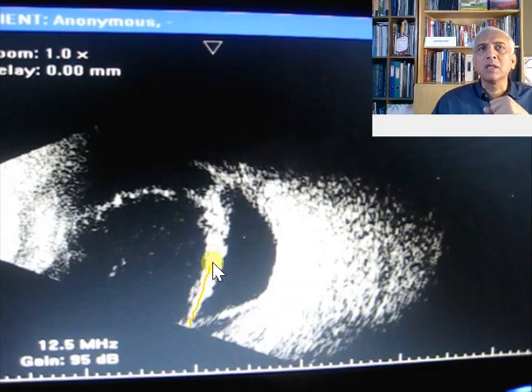The important thing is, if this whitish, hyperreflective line is attached to the optic disc, that means this is a retinal detachment. While if this line was not attached to the optic disc, then it would be a posterior vitreous detachment. And if it is attaching somewhere else and the configuration is more of a concave appearance, then it would be a patient having a tractional retinal detachment.